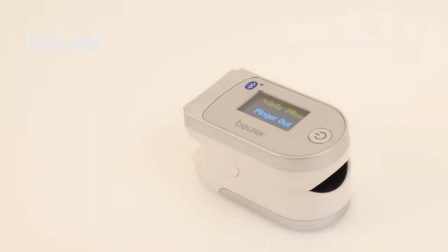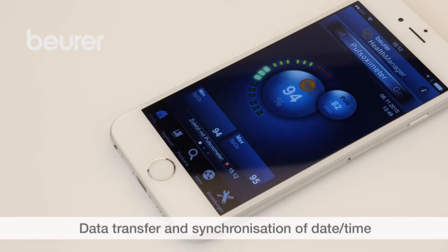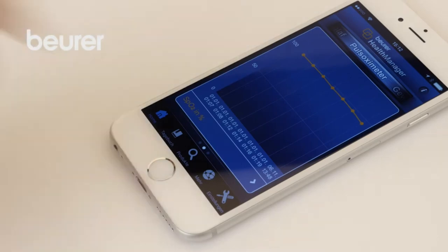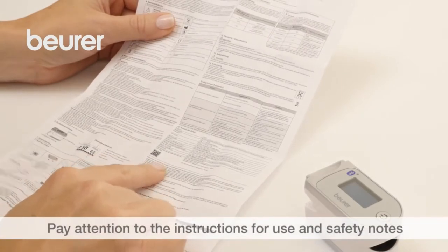If the PO60 is switched off, you can press and hold the function button to transfer the data to the app. Please also pay attention to the instructions for use and safety notes.